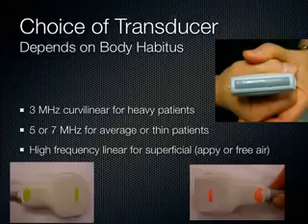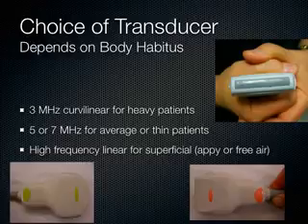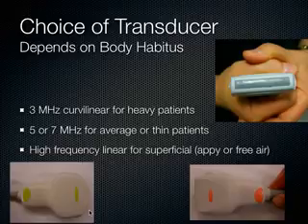So when you look at the bowel intestines with ultrasound, you would like to use, like everywhere else in the body, the highest possible frequency so you get the best possible resolution as long as you can penetrate to the depth of interest. And so usually on most patients with the bowel, like for the appendicitis and stuff, we use this linear probe. That gets us our answer almost all the time, which is great because it's high frequency. Though occasionally we have to use the lower frequency, in this case the curvilinear probe, down in that 3 megahertz range. In a larger patient, we have to turn to this transducer sometimes, but almost always I can get by if I push hard enough with the linear transducer. We get really nice images.